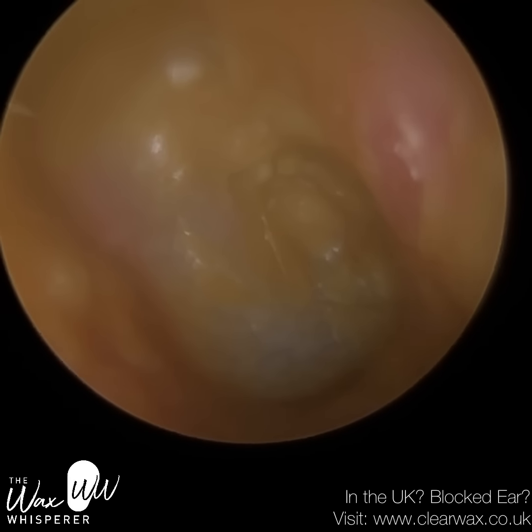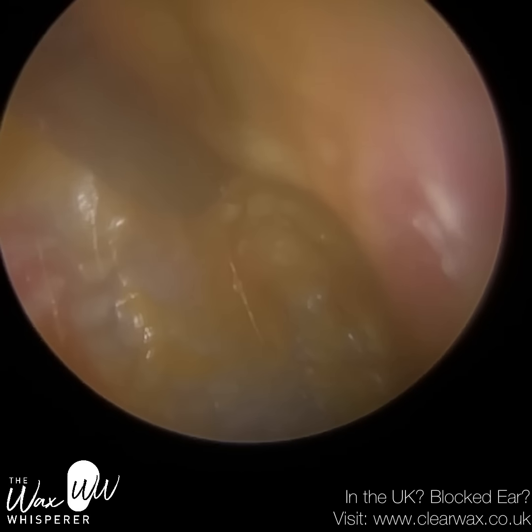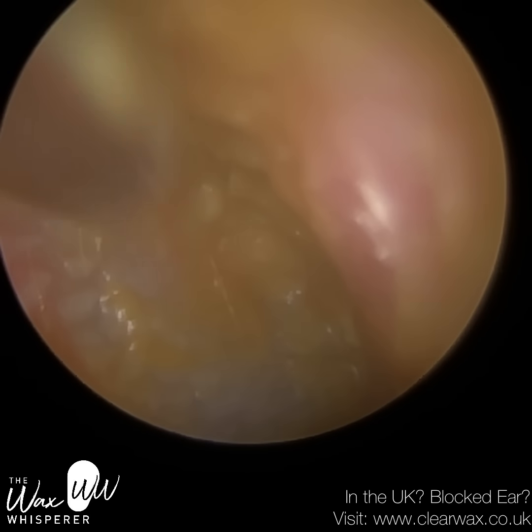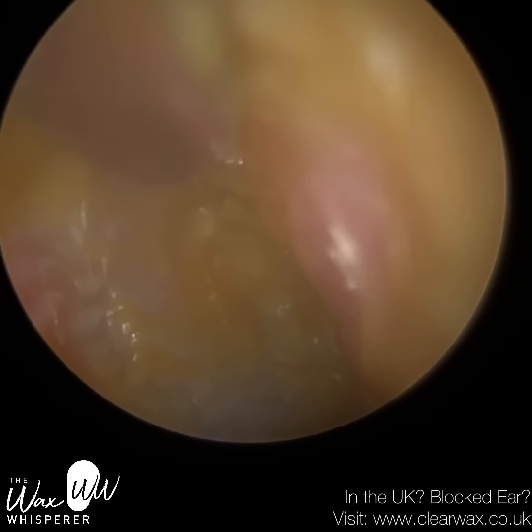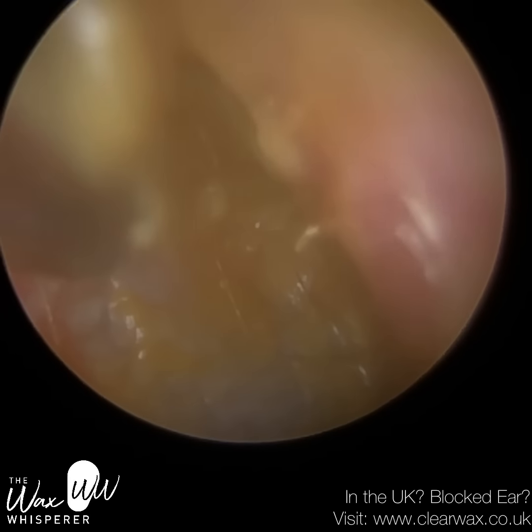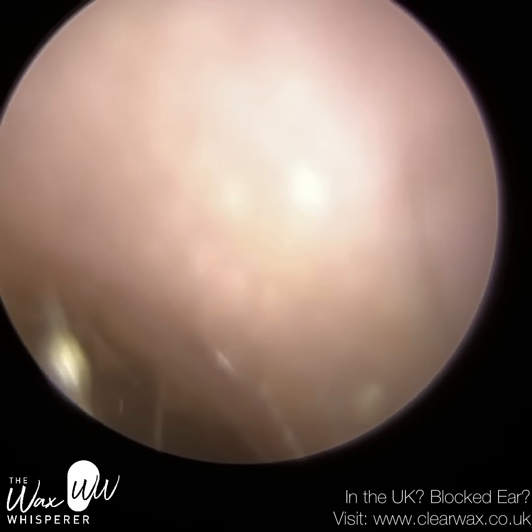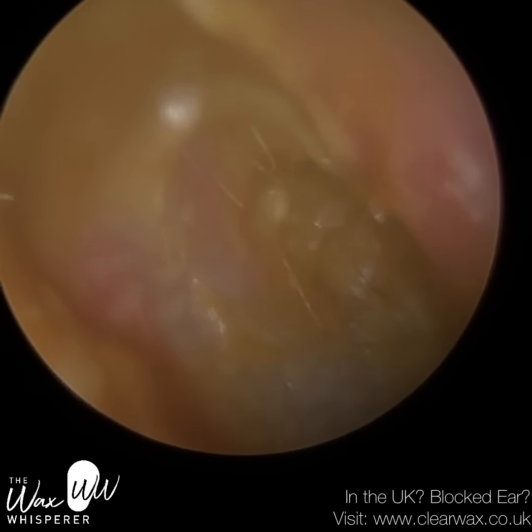So we can probably see, I would say, three-fifths of the eardrum already. And again, I'm just using the fine end, and we're actually on the eardrum. You'll probably see the eardrum flex a few times because I am putting a bit of pressure against it in order to suction this gunk out. That's the best way to describe it. It is like gunk. It's so viscous and thick and glutinous. And once more, you can see that curl, that bend in the fine end. That's very useful in this kind of case because it mitigates the risk of me again grazing that front part of the ear canal.